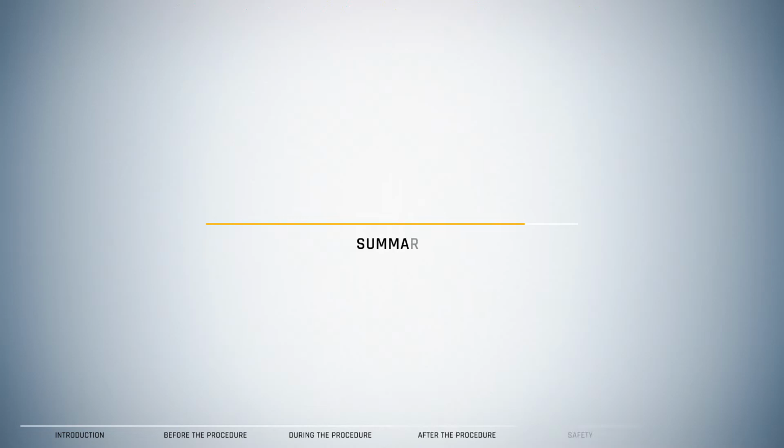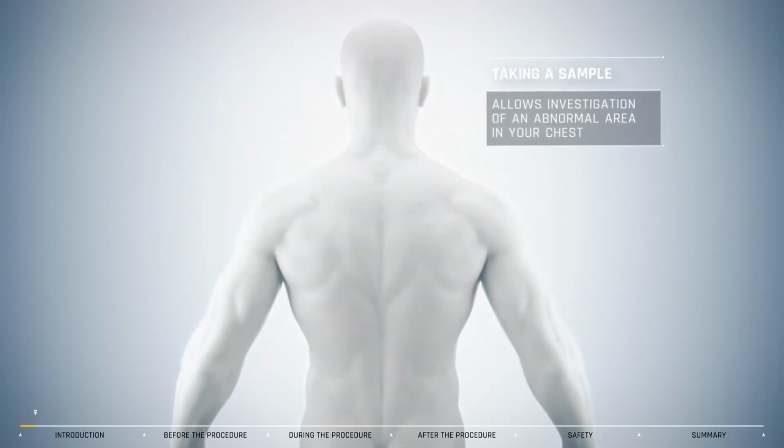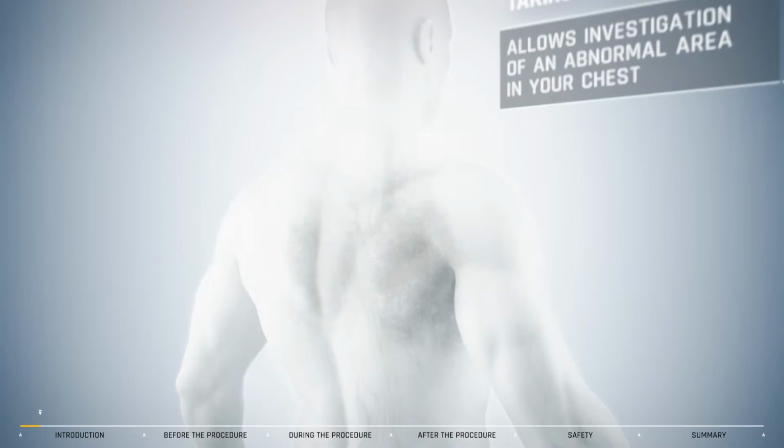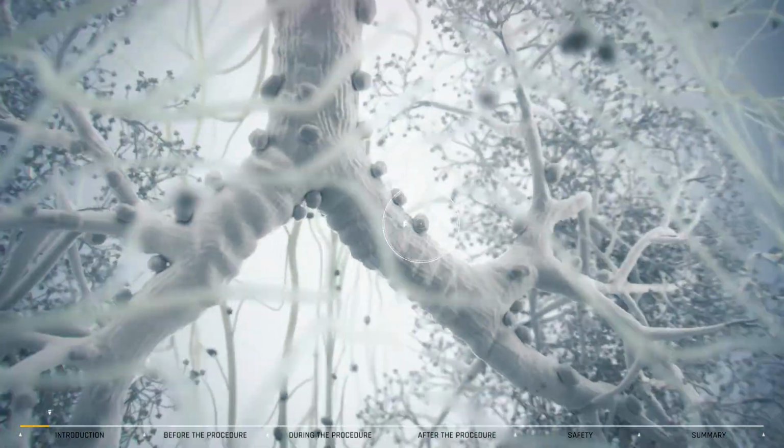You have been referred for a procedure known as an endobronchial ultrasound, EBUS. During this video, we will be explaining what you can expect from the procedure. Taking a sample is the best way to investigate a potentially abnormal area in your chest. EBUS allows a sample to be taken quickly.